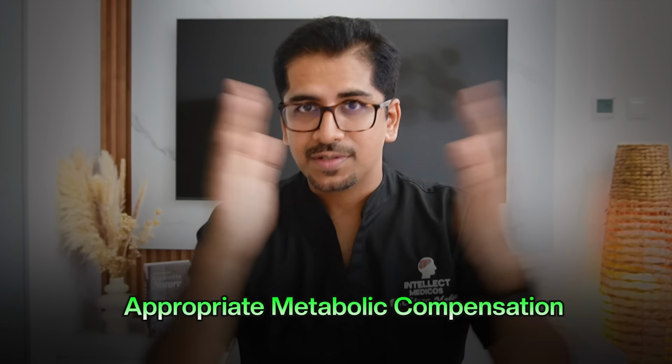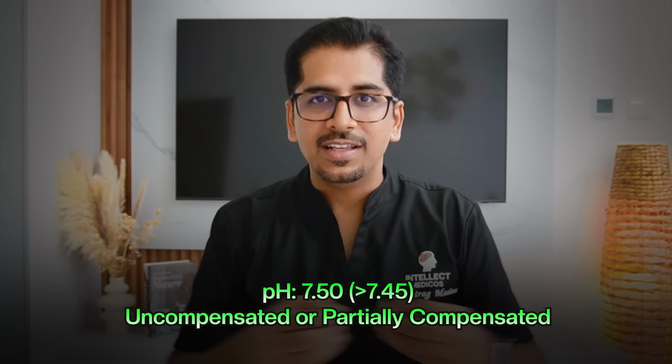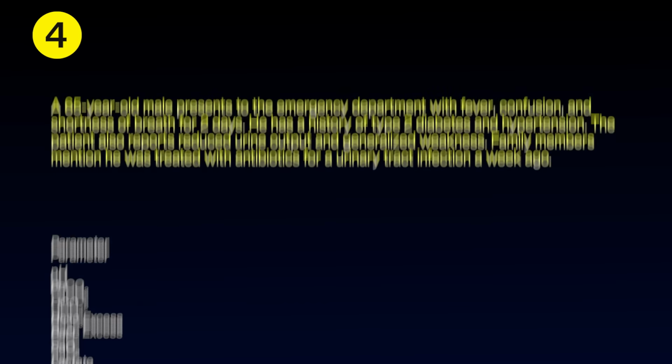And if you see the pH as a broader category, it is 7.50. That means it is out of the normal range. It is more than 7.45. Now, the summary, the crux, the final answer to this scenario or the ABG is partially compensated respiratory alkalosis with metabolic compensation. Clinical scenario 4.